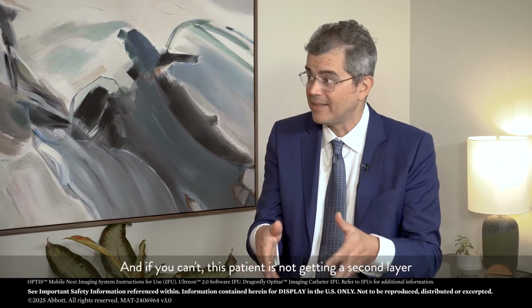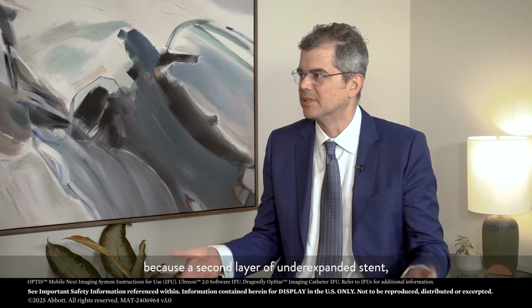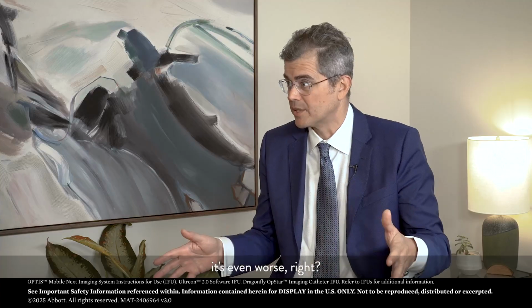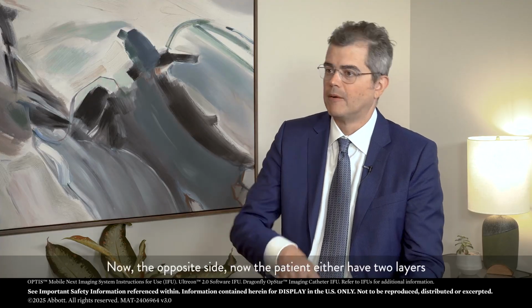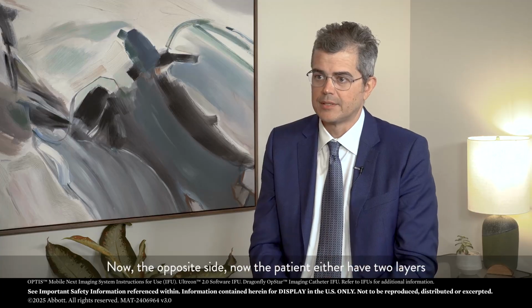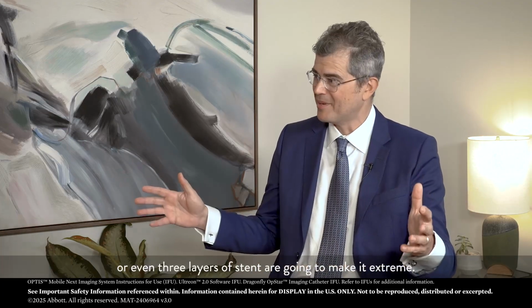And if you can't, this patient is not getting a second layer, because a second layer of underexpanded stent is even worse, right? Now, on the opposite side, the patient already has 2 layers or even 3 layers of stent.